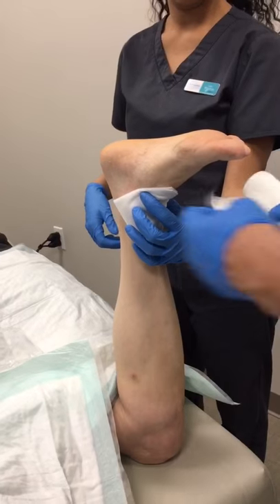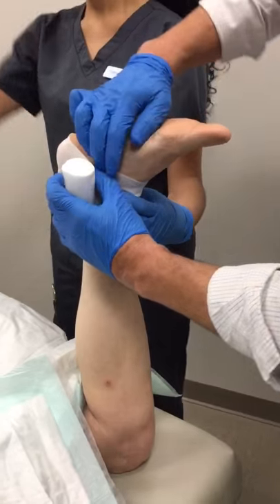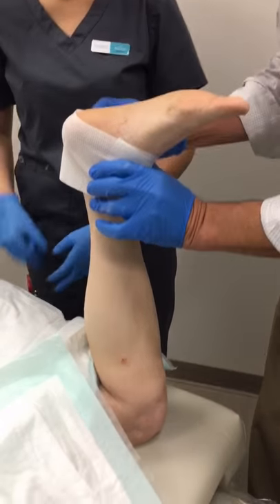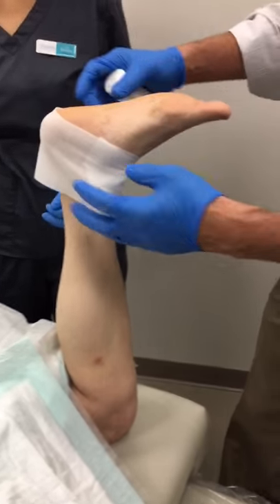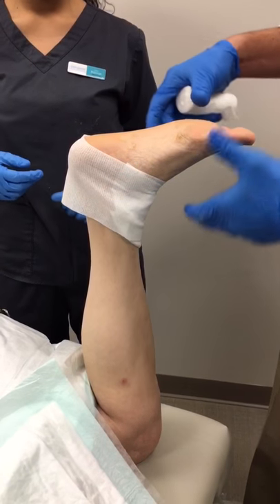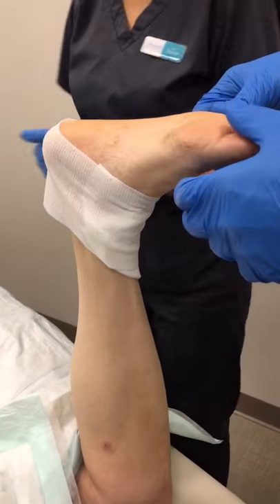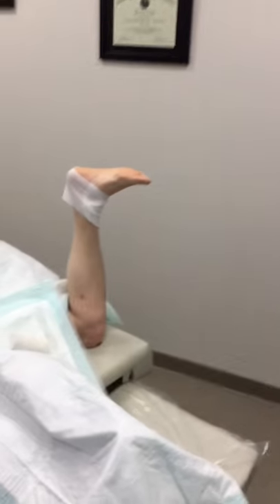The web roll is a single layer, and the reason is that after surgery especially, if the ankle bleeds, then the dressing can act as a tourniquet. So it's a single layer such that it doesn't act like a tourniquet, but it's simply holding the 4x4 on top of the incisions themselves. Now we're ready for a bulky Jones — the bulky Jones can be split in half just manually.